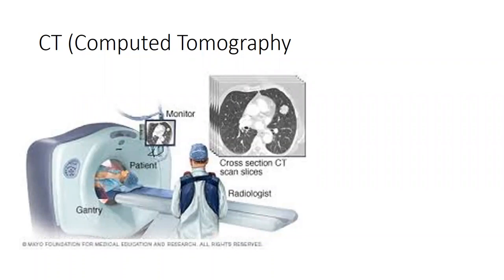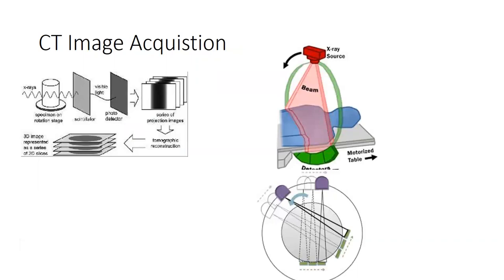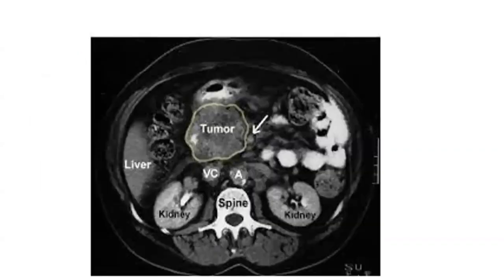But you really want to be judicious in the use of x-ray, because cumulative exposure over time can lead to cancer, okay? Or radiation poisoning. Typically, you're not getting high enough doses for radiation poisoning, but a CAT scan lets you get this cool series of images. And this schematic kind of shows you how the high definition arrays spin in space. And then you're kind of stacking those images here, okay? And you are making this image that you can now manipulate and look at and gather a huge amount of data from, all right? So that's how CAT scans get acquired.